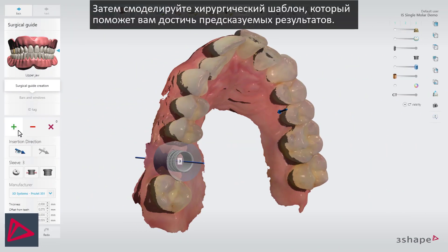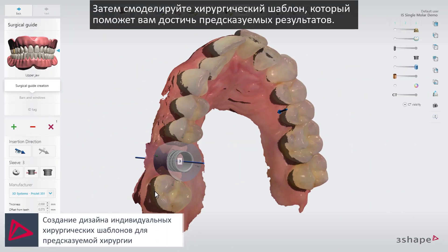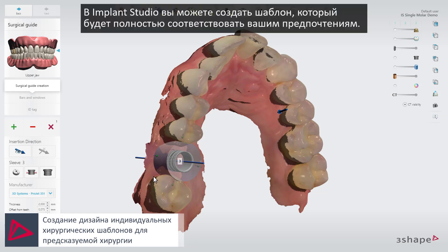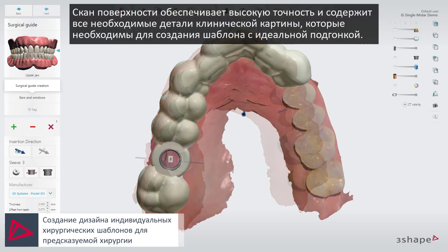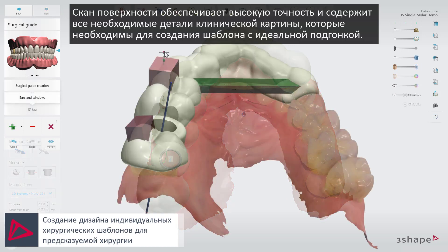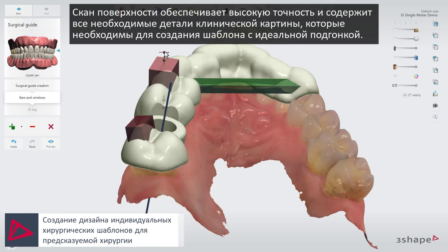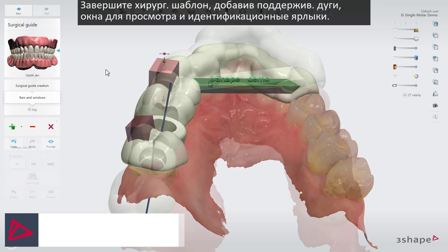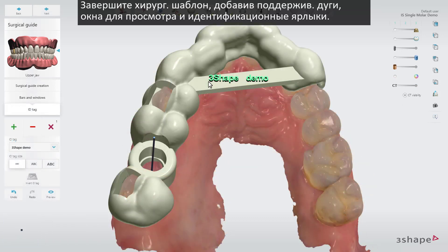Next, design the surgical guide, which helps you to achieve predictable results. In Implant Studio, you can design the guide completely to match your preference. The surface scans provide you with high accuracy and all the details of the clinical situation required to design a precisely fitting guide. Finalize your guide by adding support bars, viewing windows, and ID tags.